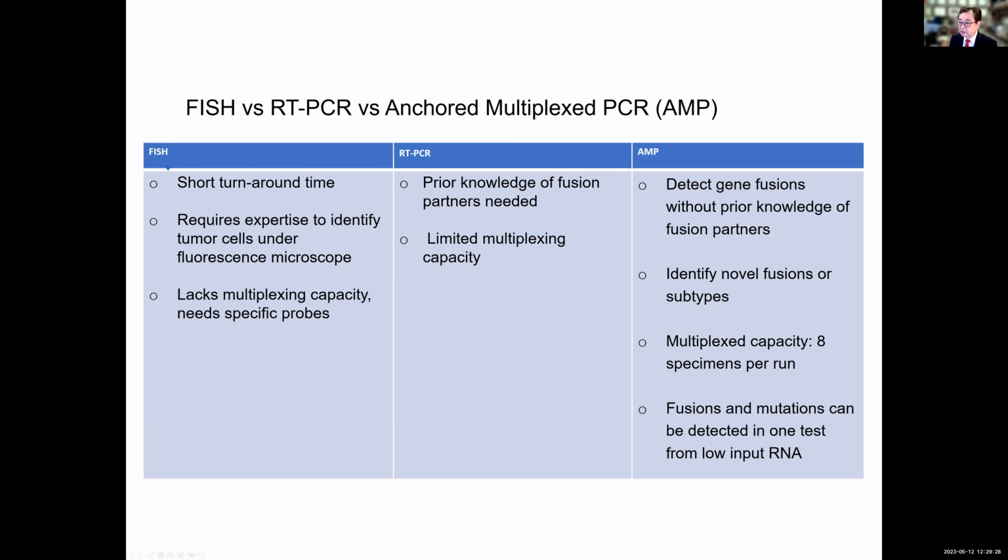So here is a list comparing the three technologies to identify the mutations. FISH, I have used several times; it's a classic, relatively older technology. It's still valuable. You just have to be careful. You need to evaluate the morphology first with a very short differential diagnosis.